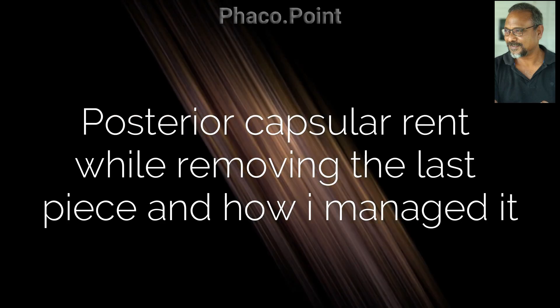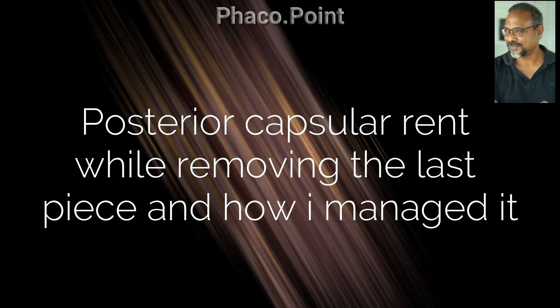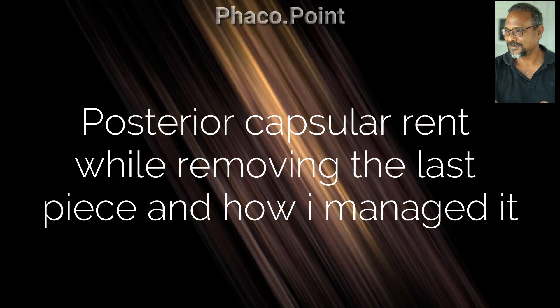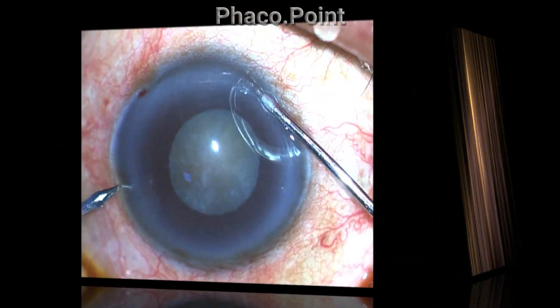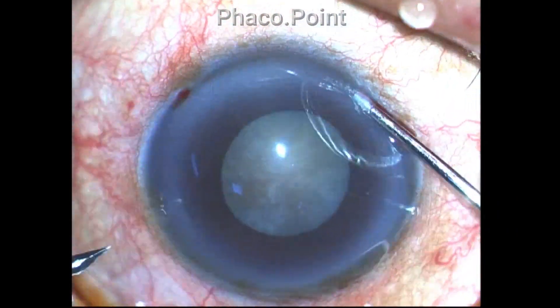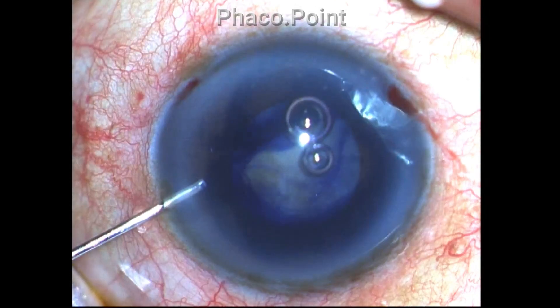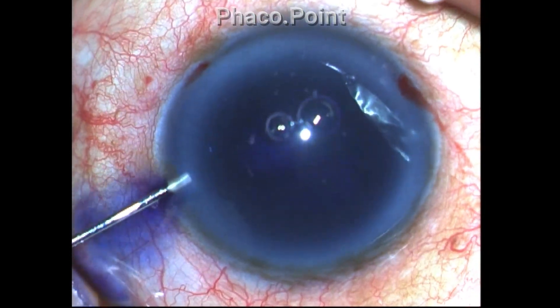Hello friends. In this case I encountered a posterior capsule rent while removing the last piece, and I'd like to show you how I went about managing it. But let's start from the very beginning of the case and the peculiar challenges that were presented in managing this case.